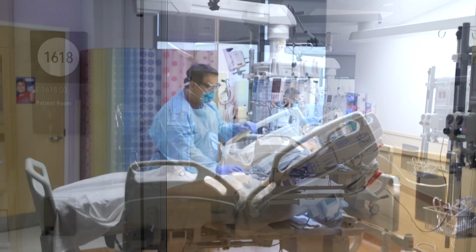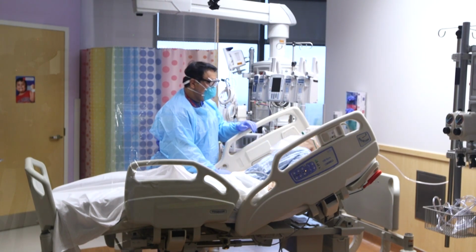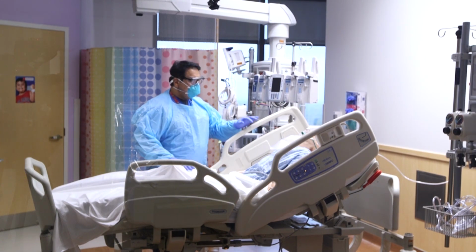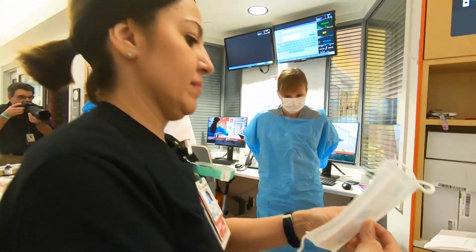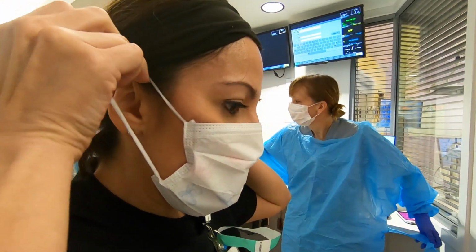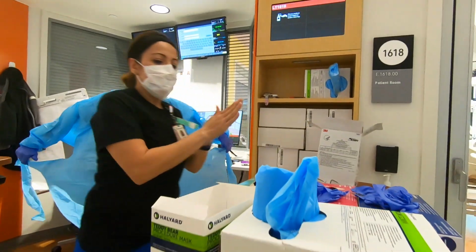Full personal protective equipment for all personnel taking care of a patient with COVID-19 is critical when preparing for intubation. We want to emphasize minimizing personnel during aerosol-generating procedures. You will see the team preparing with their PPE outside of the room.